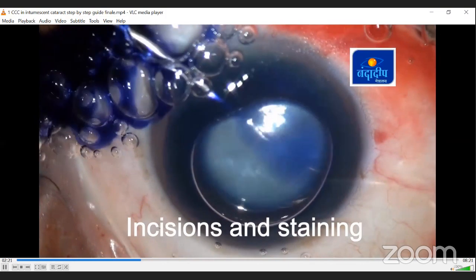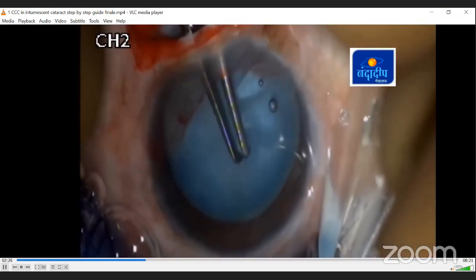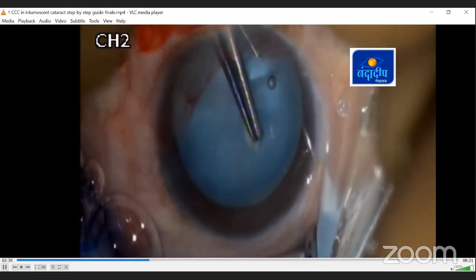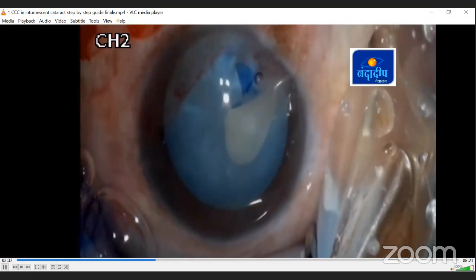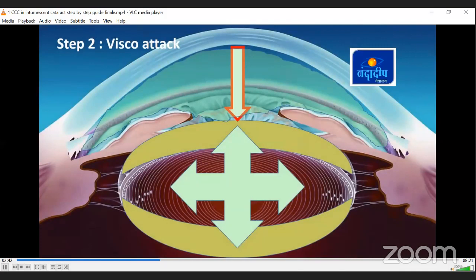As I mentioned earlier, few studies have shown that staining reduces elasticity and increases the stiffness. So just watch here the surgeon trying to do rhexis in an intumescent cataract from the large main incision. Obviously, the rhexis goes out because now there is no counter pressure against the intralenticular pressure. So the second step is, as I was explaining, balance the intralenticular pressure by using a higher molecular weight OVD.